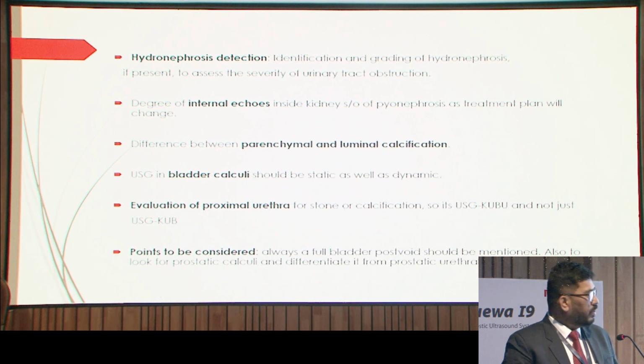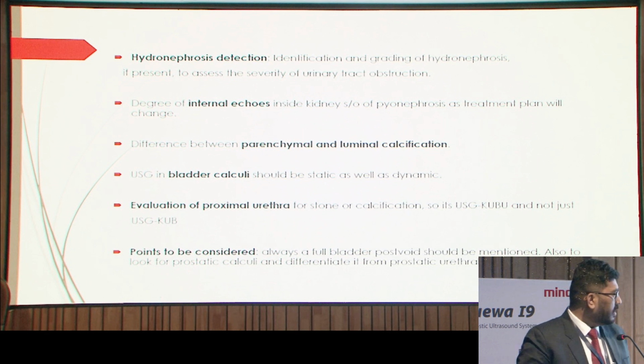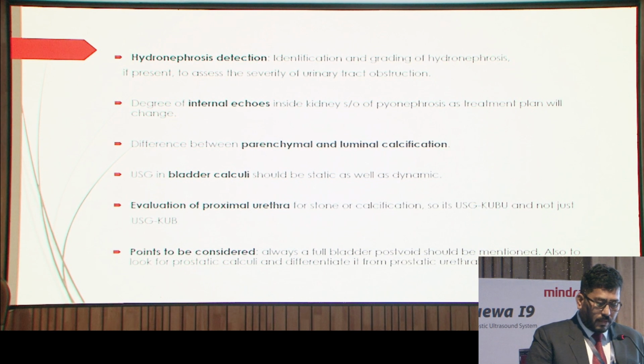Then coming to the bladder, sonography for bladder calculi should be done in both static as well as dynamic ways, so that bladder calculi are properly diagnosed. Then evaluation of the proximal urethra for stone should be done. Sometimes a prostatic urethral calculus is missed and the whole scenario changes on the table.